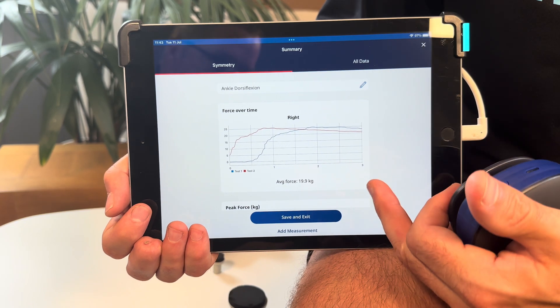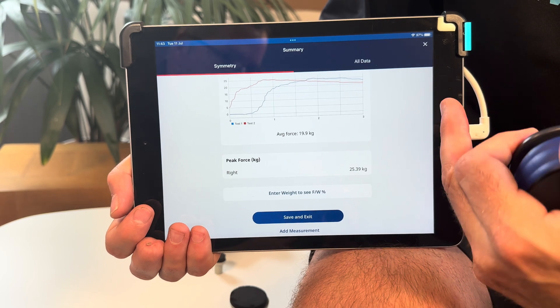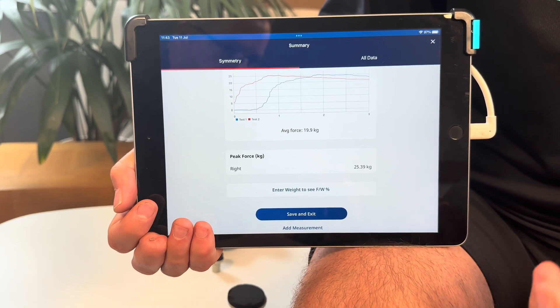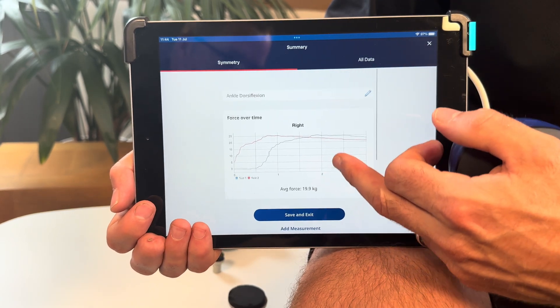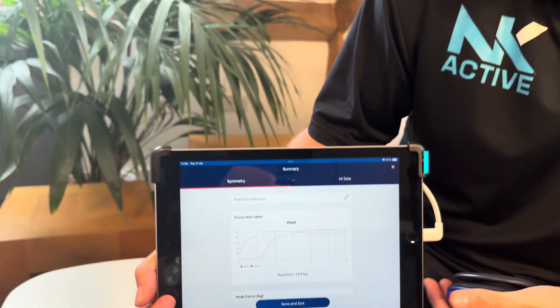We'll skip this side for the sake of the video. After that, it gives you a nice graph showing your peak force, and if you do left and right it will show the difference between the two. You can also enter the weight to get the force-to-weight ratio. But in a nutshell, those graphs don't really mean anything to patients — it means something to us, but when we speak to patients they don't really care about those graphs.